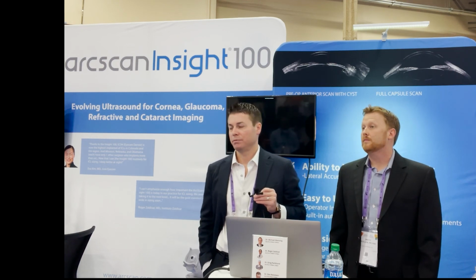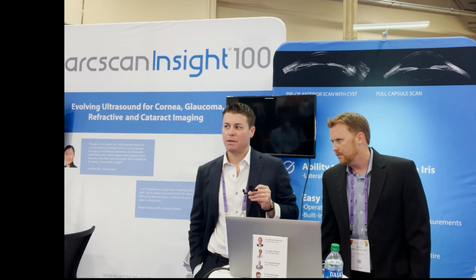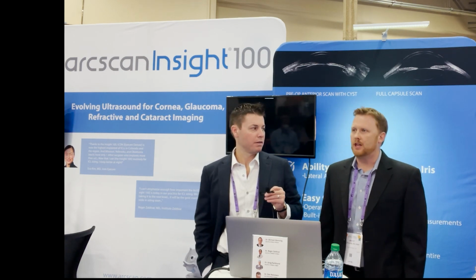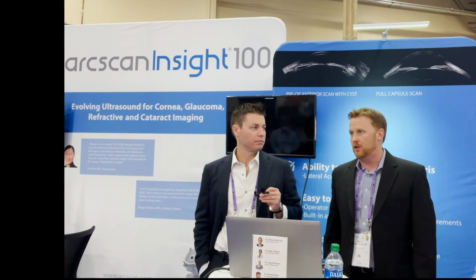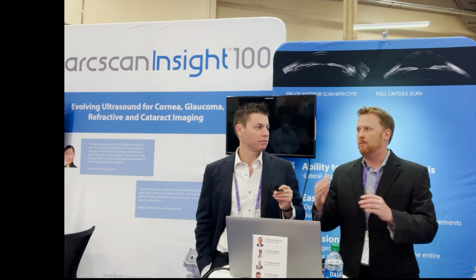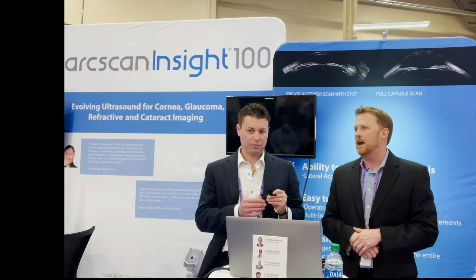Have you looked into the data, like compare what the white to white lens length you have recommended versus using the ArcScan? We're going to be doing that. So that's going to be in our data analysis once we've collected all. But yes, we'll do that and say, what would the white to white measurement have predicted, and then how is that different from what the ArcScan, and what percentage of that, and how big of a change is that going to be? So yeah, that is something we're going to be looking at with our data.